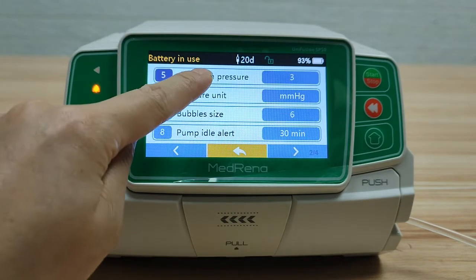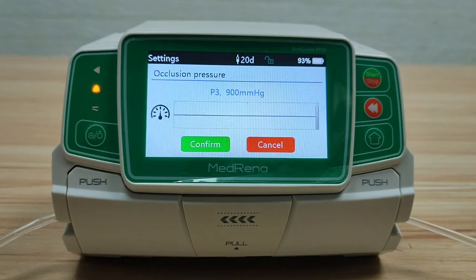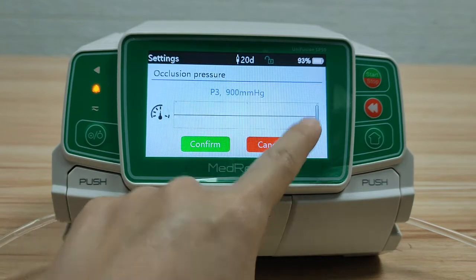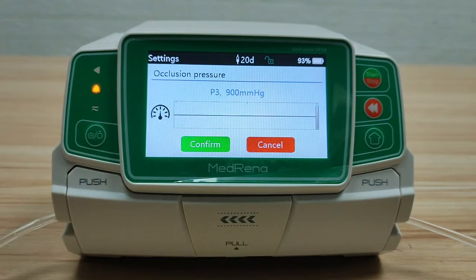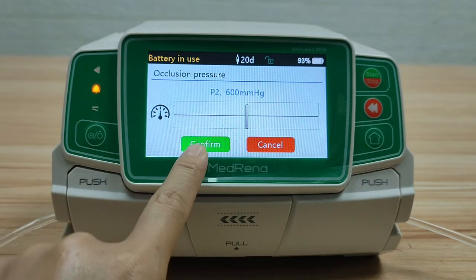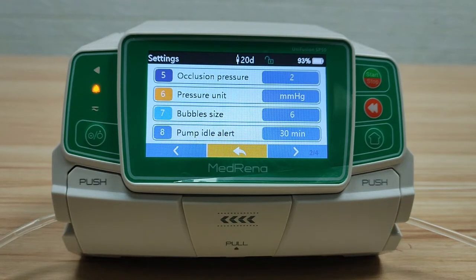Occlusion pressure: this model has three occlusion pressure levels — 300, 600, and 900 mmHg. We can select which level to trigger the alarm. Besides the preset levels, occlusion pressure levels can also be customized.